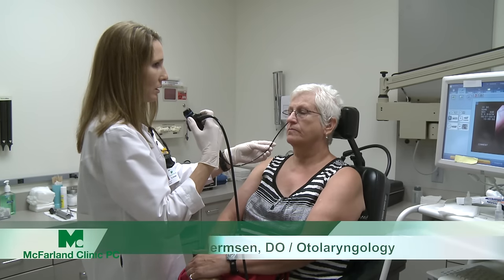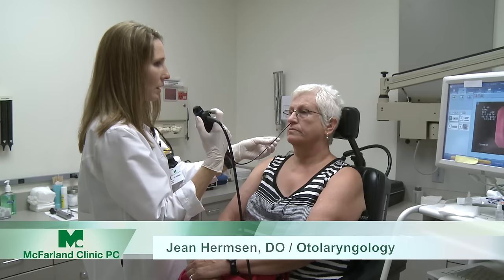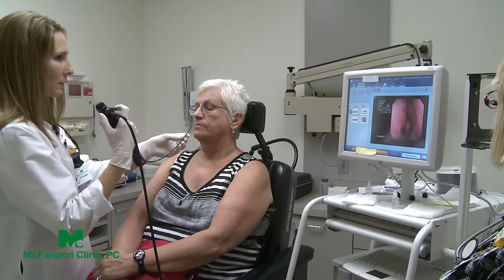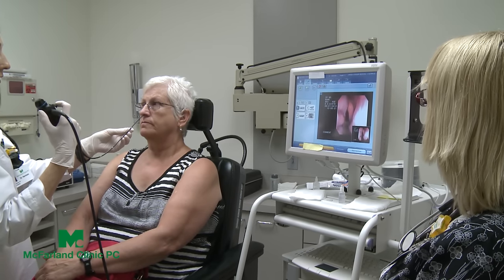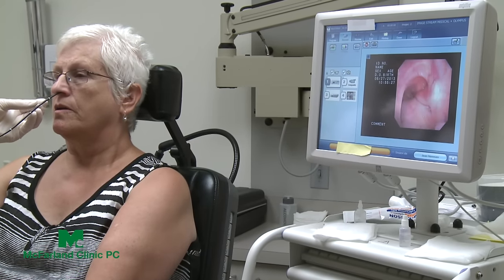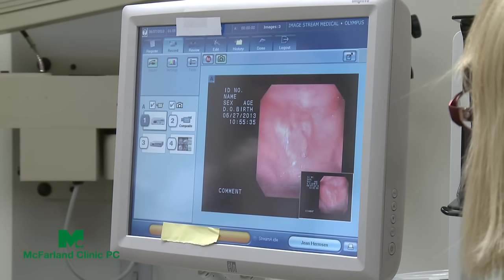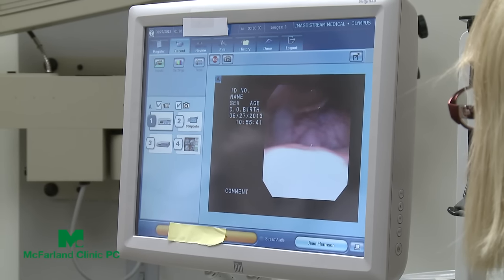Just breathe through your nose. When we look first at the inside of the nose, both sides are pretty open. You may feel some pressure between your eyes — sorry about that. Now we're at the back of your nose, just breathe through your nose for me. Looks pretty normal, I don't see a lot of drainage. Bear with me — you're doing excellent.